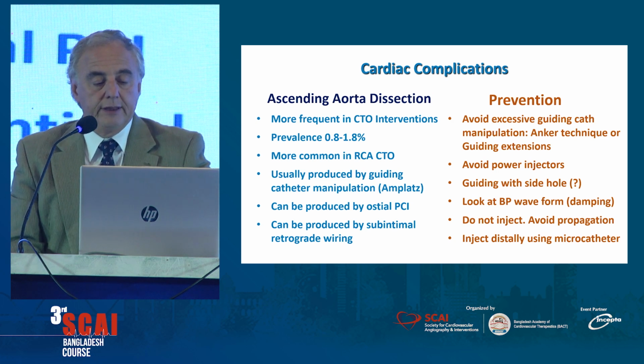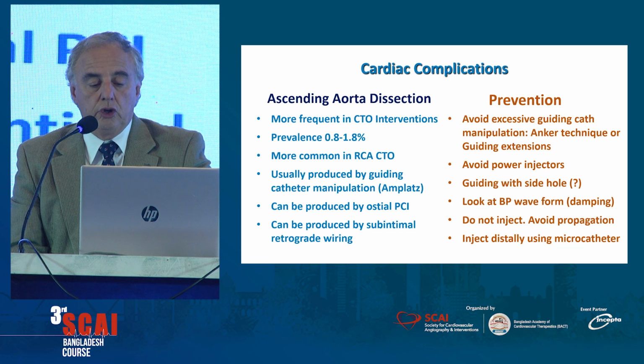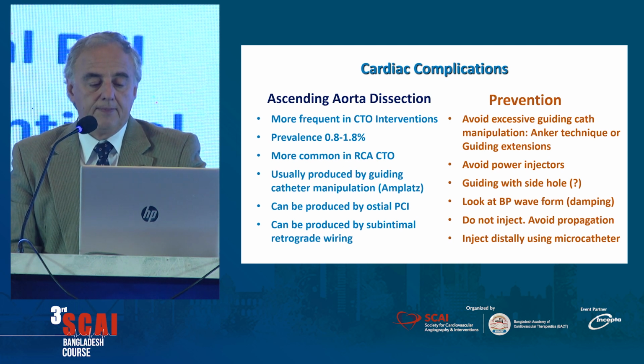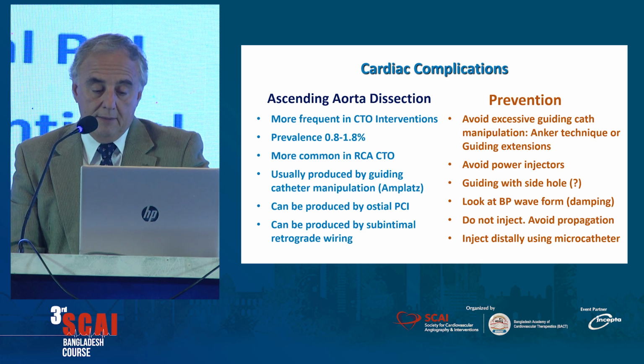So how to prevent this? Avoid excessive guiding catheter manipulation, use techniques like guiding extension or anchor technique, and avoid power injection. I do not know if it's popular here in the United States. It's popular to use the power injection. I do not think that should be used in CTOs. Guiding catheters with side holes, in my opinion, are questionable, but some people like to use them.